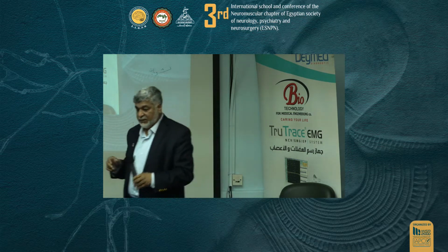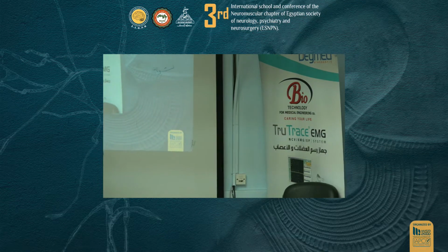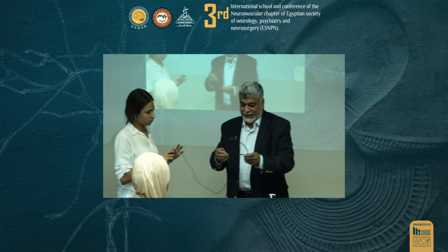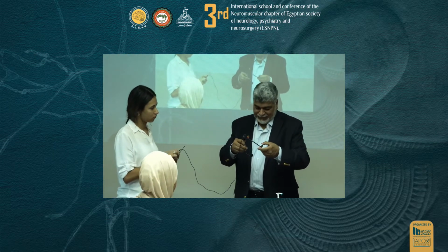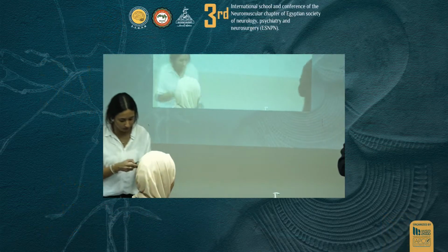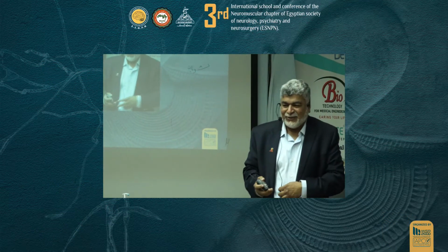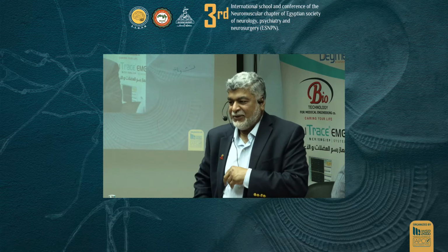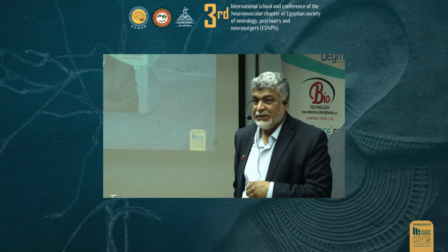So in the interest of time, I'll get to the patient, and I'll try to keep talking. Luckily, we don't require tape. Many tapes over here. We just require one tape to ground the. Can you hear me? Okay. Technically less challenging and also more interesting, trust me. Okay, so but a little painful. I'll explain to the patient.